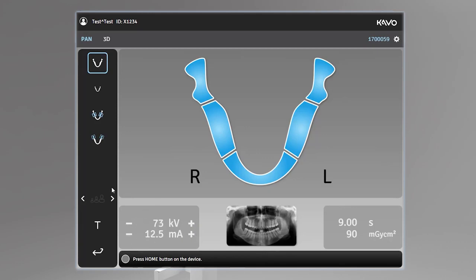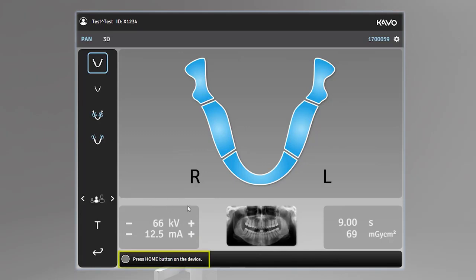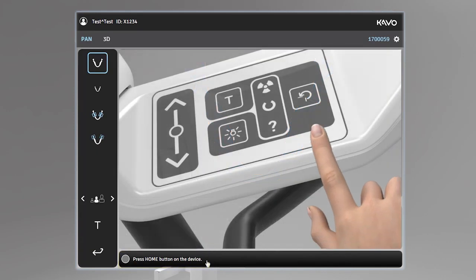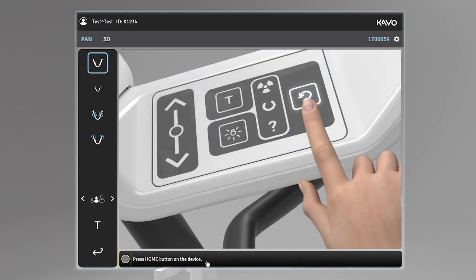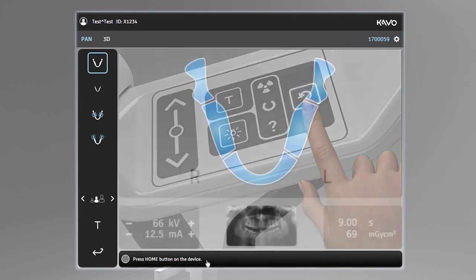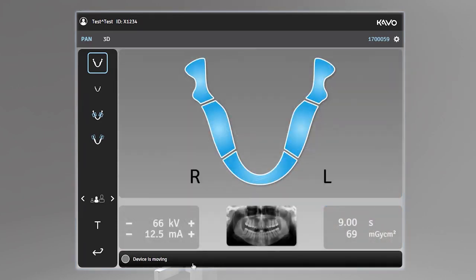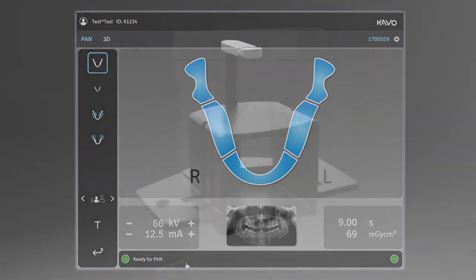Now that the patient size and protocol have been selected, the device status indicator message bar displays the device status with a color-coded indicator. A gray indicator means that the device is not ready and will be accompanied by a prompt indicating steps for resolution. A green indicator lets you know the device is ready for imaging.